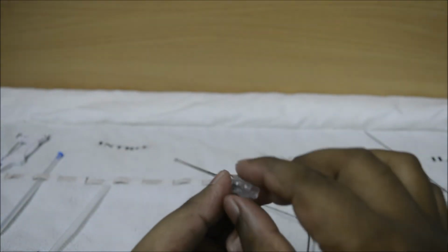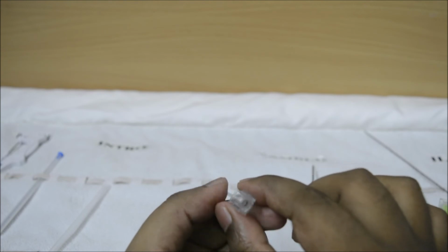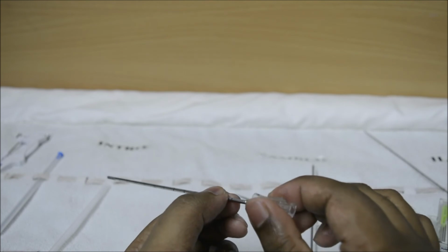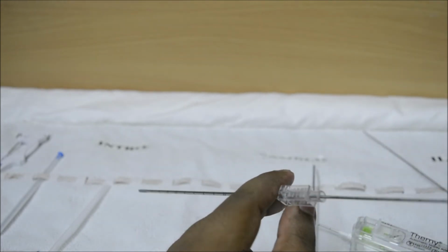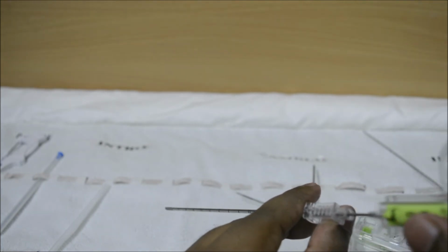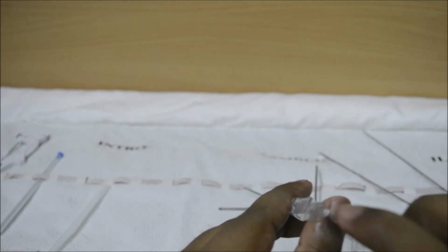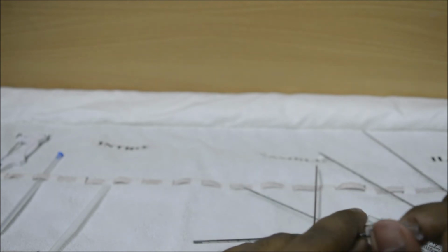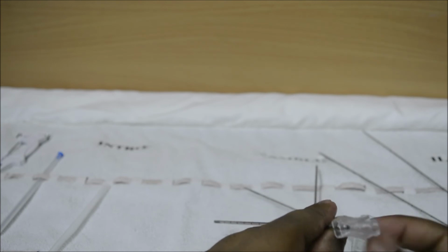Once it is removed, as you can see, the entire inside part is completely hollow. So you can perform any procedure from inside the coaxial needle. For example, the needle is inserted, you need to perform a soft tissue biopsy. So you insert the soft tissue biopsy needle and the procedure can be performed, post which you want to insert a marker. So you can use this hollow channel. This is basically creating a channel, this hollow channel, to perform another procedure. So this is how the whole thing is performed.